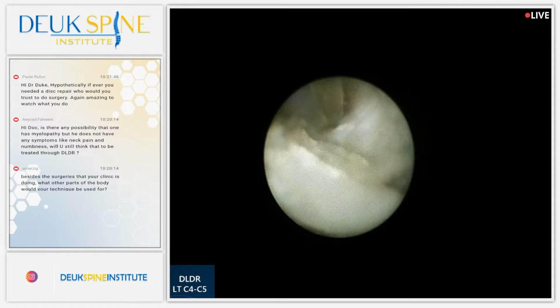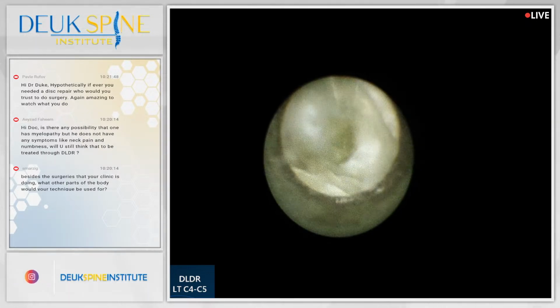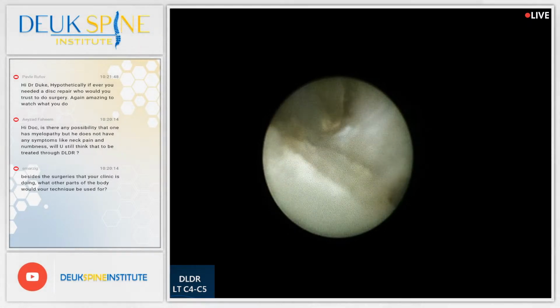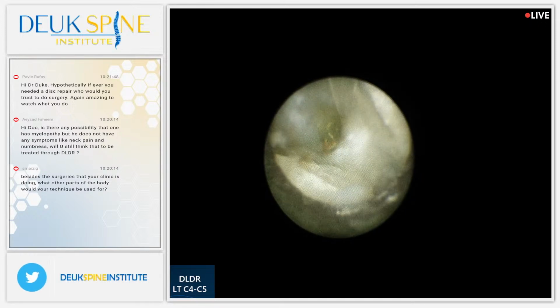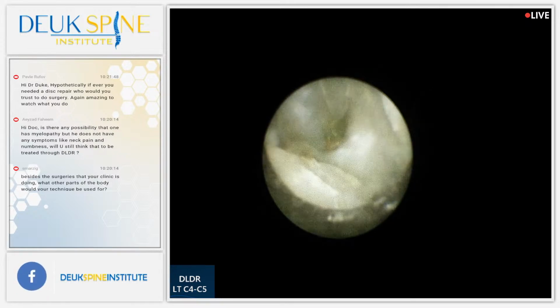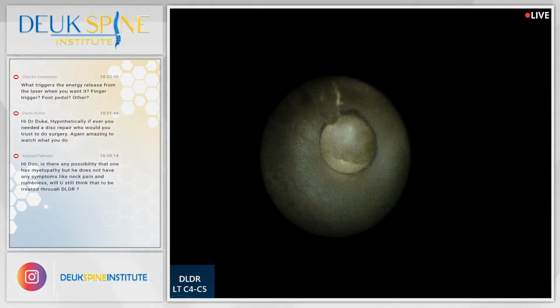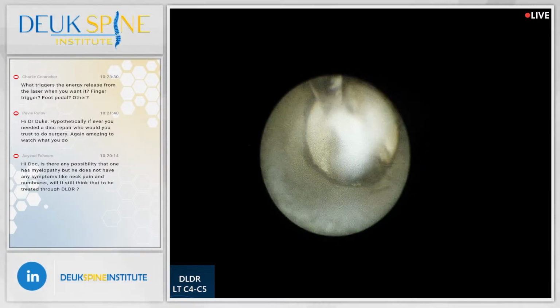And remember, you can never get 100%. For those of you who watch my surgeries, I always say the same thing. We're never going to get 100%. We need to get enough of this out to get rid of her symptoms and take away her risk of basically spinal cord injury, or reduce it massively. That's probably as much as I'm going to get. What's left is just a shell, and it's really not pushing anymore on the spinal cord. That said, I want to check the other sides and check the foramen. Make sure we get all the herniation out of the foramen.